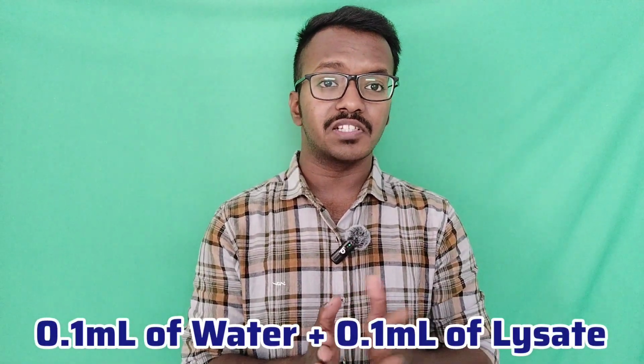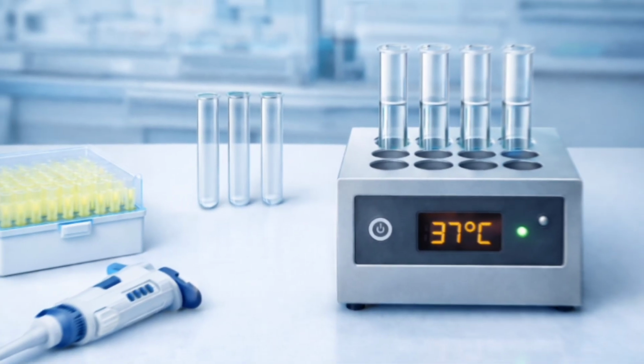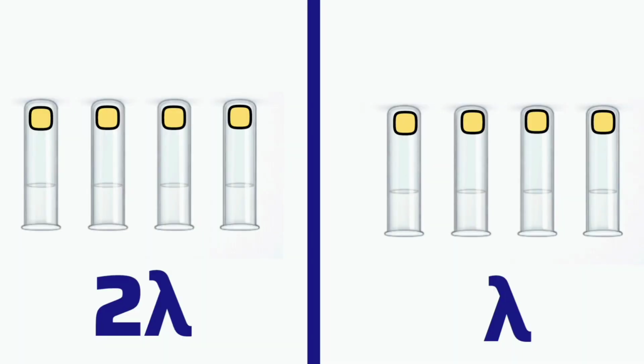For the negative control, we should add 0.1 ml of endotoxin free water and 0.1 ml of lysate. Then incubate all these tubes at 37 degrees Celsius for 1 hour. After completion of incubation, observe the result. While inverting each and every tube around 180 degrees, the negative control should not show any gel clot formation. If a gel is observed in 2 lambda and lambda, record the result as positive.